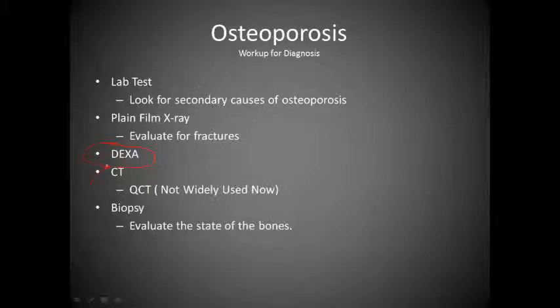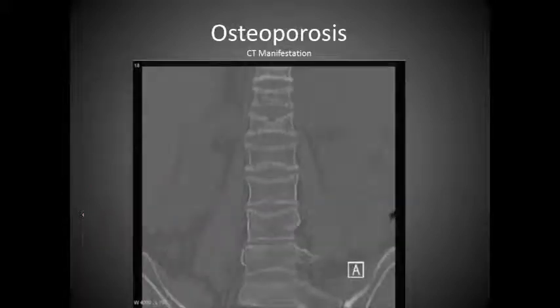However, CT used to be used. Some facilities still use QCT, but it's not widely used now to demonstrate whether the patient has lost significant amounts of bone mass. And then for the most extreme cases, biopsy can be performed to evaluate the state of the bones. However, DEXA has kind of eliminated everything and now is the go-to method for diagnosing osteoporosis and following the prognosis.